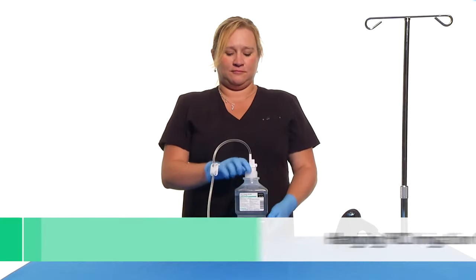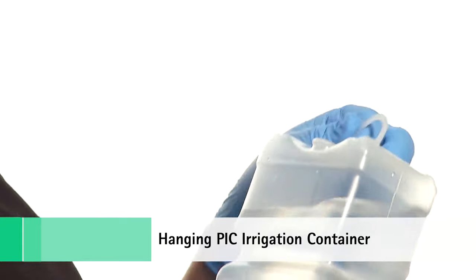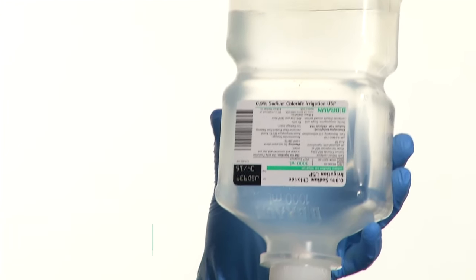To hang the PIC after spiking, invert the bottle and flip the hanger tab upward. Holding the bottle with one hand and the hanger tab with the other, hang on an IV pole.